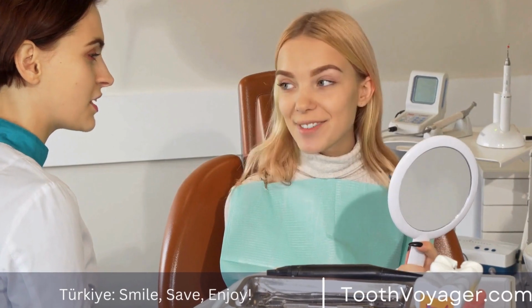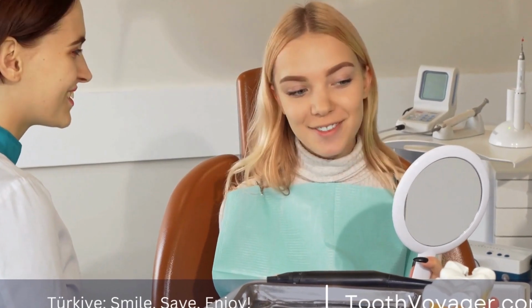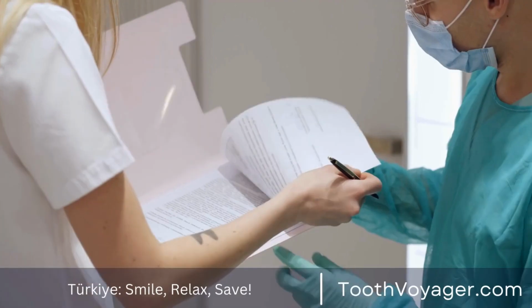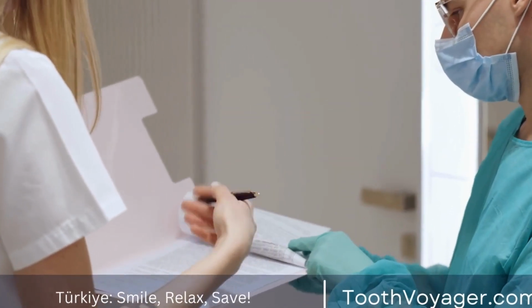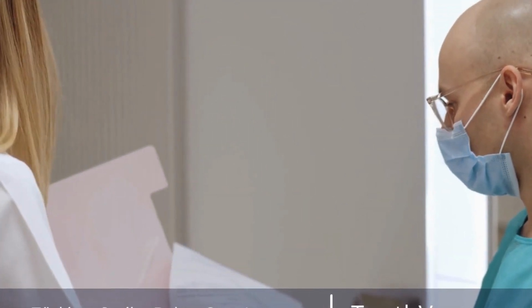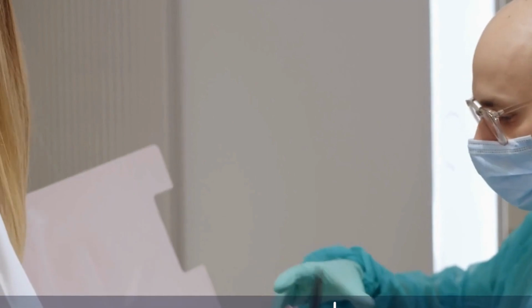Alongside technical expertise, technicians must possess an eye for design in order to create an appearance that is natural and blends into the surrounding teeth. They should be able to reproduce the subtle details of natural teeth, like transparency and texture, so that a crown cannot be distinguished from the other teeth in the smile.